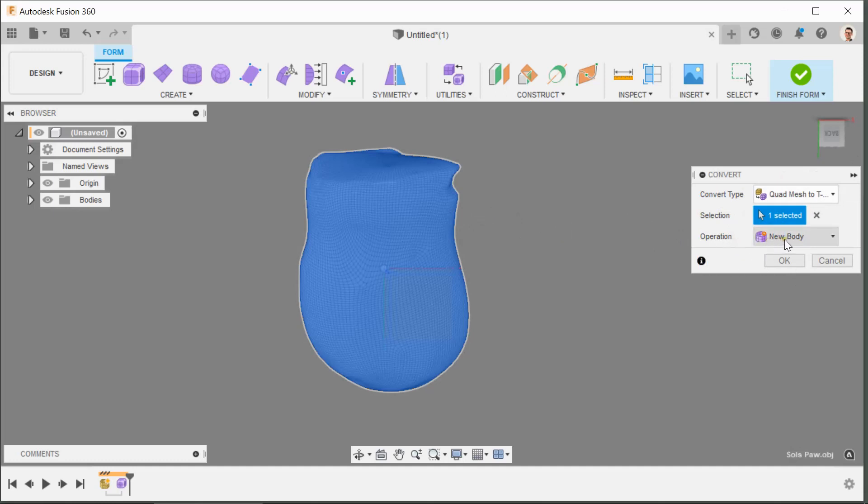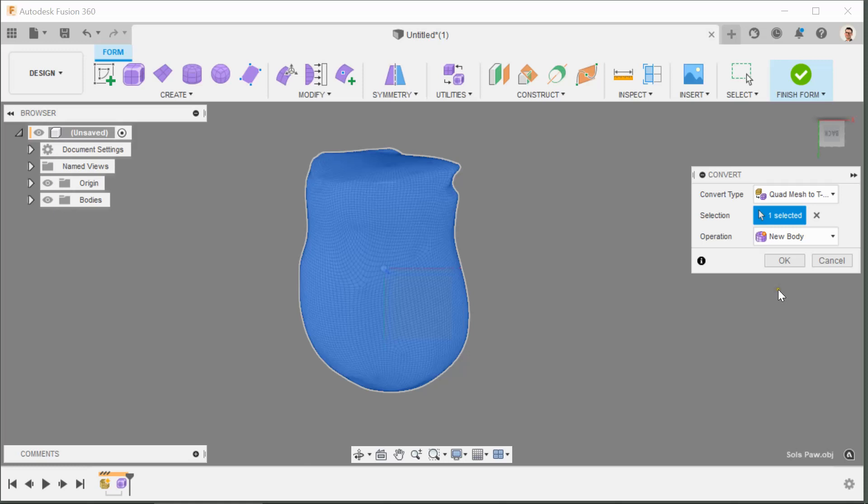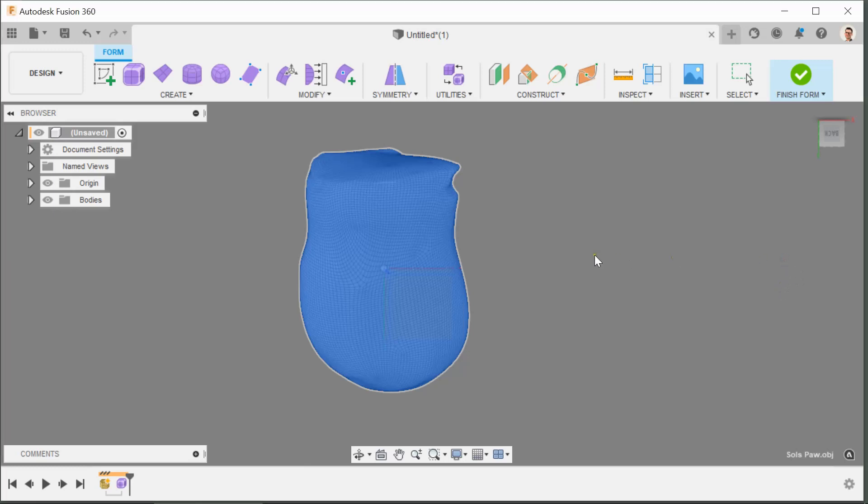And then the final operation is to convert it to a new body. That's the only option that we've got from quad mesh. So there are other options available, they will not work. This is the exact configuration that you need. Okay, and we're still not quite out of the woods yet. So that will convert the quad mesh.